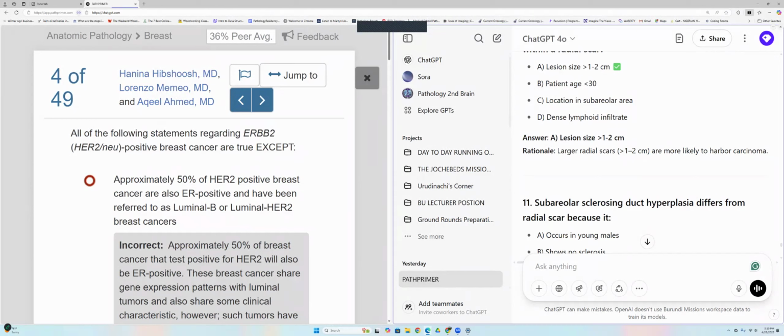Then also it is positive for S100. But normal tumors, especially luminal tumors of the breast cancer, will be ER, PR positive, S100 negative. Then there are also myoepithelial markers, of course. So now we stop somewhere on that.